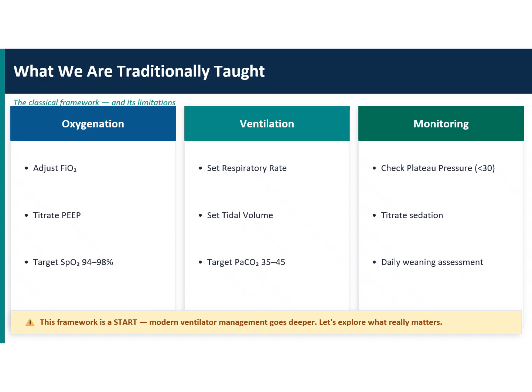We discussed the driving pressures. Driving pressures are better than plateau pressures, because with plateau pressure you want to keep it around 30 probably. But if there are chest wall issues, then the plateau pressure is going to mislead you. When you look at driving pressures, that thing is sorted out. So driving pressure is more important than plateau pressure. If your driving pressures are less than 15, even if your plateau pressures are going to 35, you should not worry about that, right?